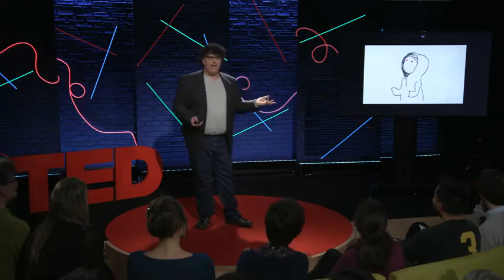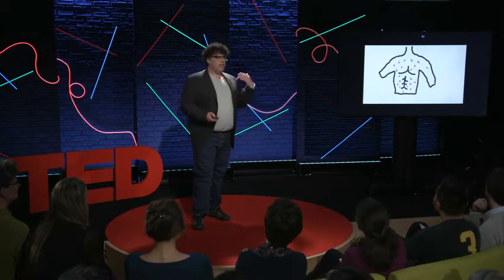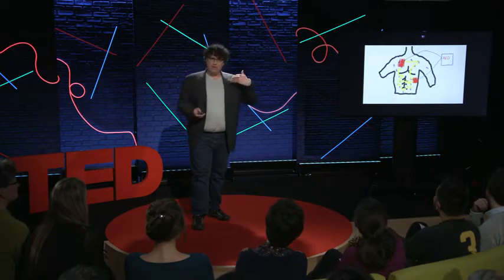For those who know what arcing is, do you remember the Emperor when he shoots electricity at the end of his fingers? That would be kind of like arcing. Another thing, by the way, he creates that by wearing wool socks under his robes. We can also get arcing if we have an extremely wet chest. The electricity travels across the surface instead of through the heart.